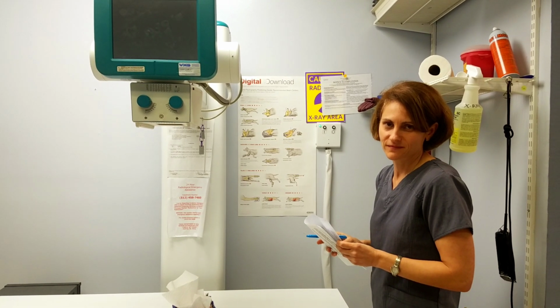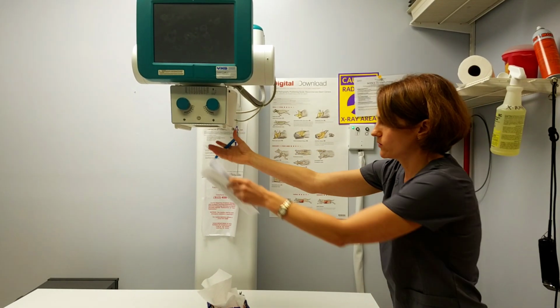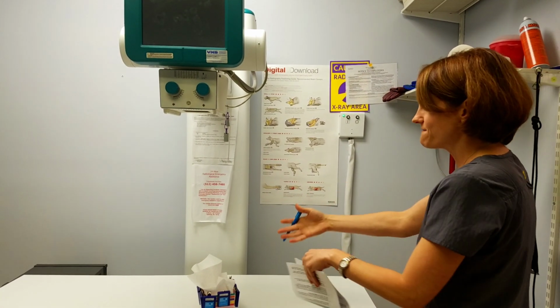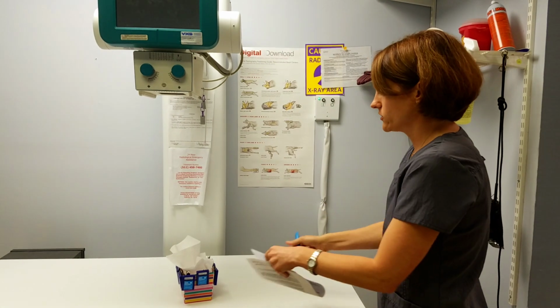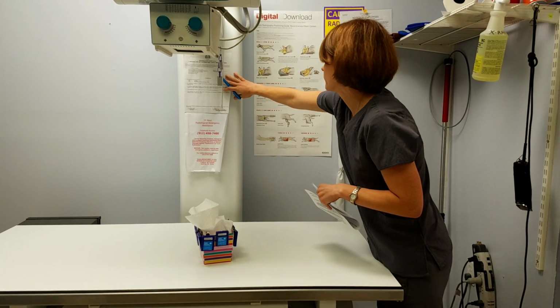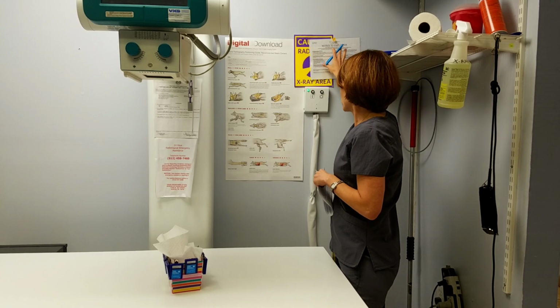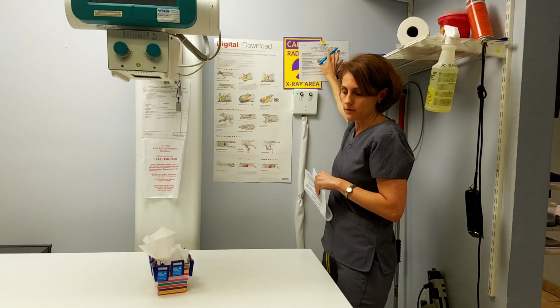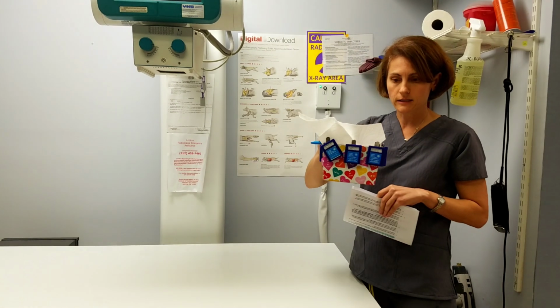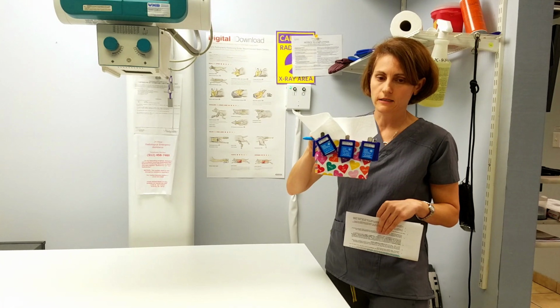So I will now take you on a quick tour, show you all the things that we talked about. Okay. So we're here in radiation. Again, you can see this is where the beam is generated. This is where we're wanting to get our bodies as far away as possible from the beam when you're shooting x-rays. This right here is our state veterinary registration. This right here is the notice to employees that has expectations and rules and regulations for employees. So that's where those are located. This is the box of monitoring badges, and I'll show you in just a second where that is normally kept.